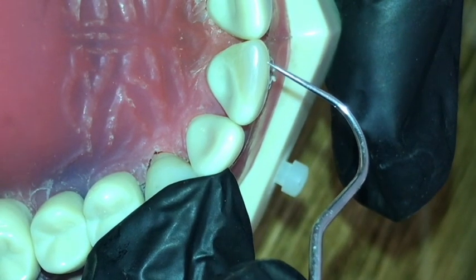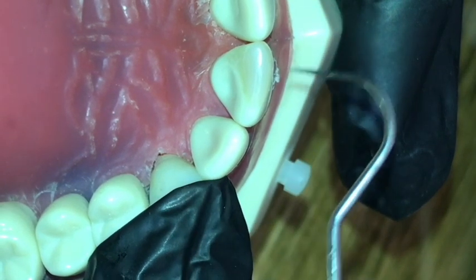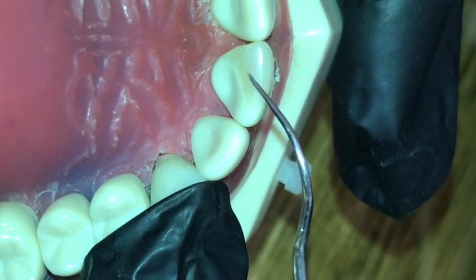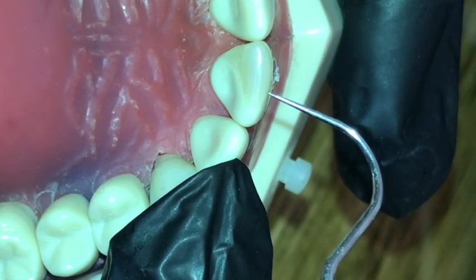And also looking at your labial contour from this angle, it should be continuous with the rest of the tooth and also as compared to the adjacent. This is what we call preserving the natural contour.